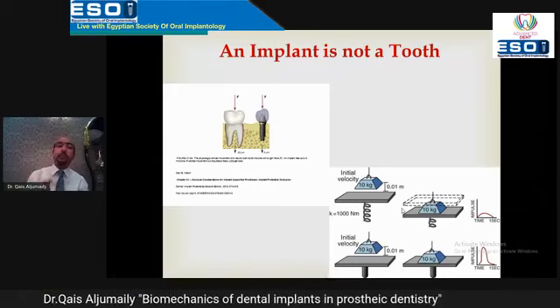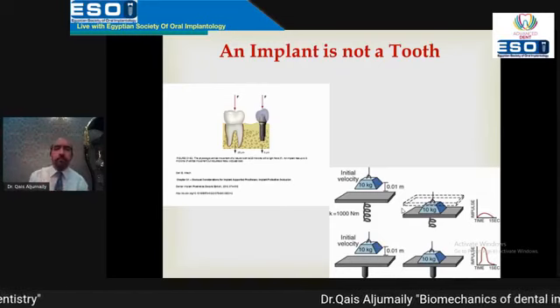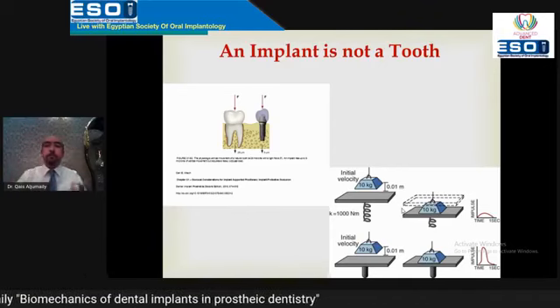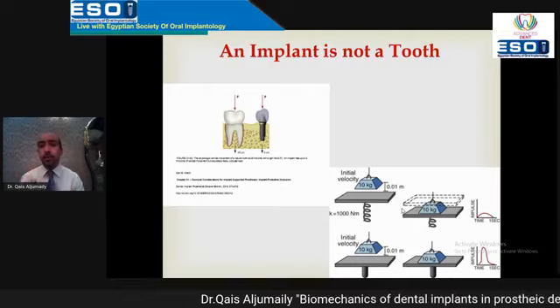معناه ما عندي هذه الحركة. ماكسيمم موفمنت ممكن توصل إلى 5 مايكرون، يعني 0.005 مليمتر. It's about nothing. لأنه ما عندي الكوشنج أو ستريس بريكر أو الكوشنج إفكت أو الشوك absorption of the periodontal ligament. معناها الإمبلانت is not like the tooth.